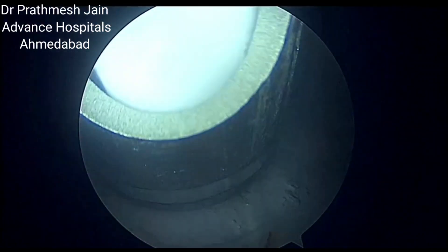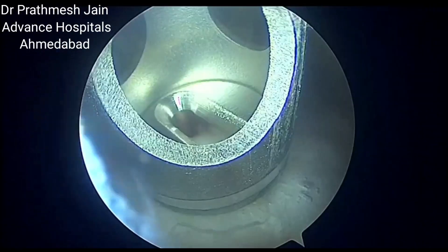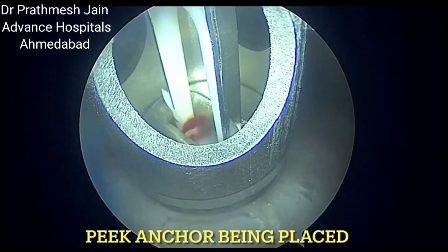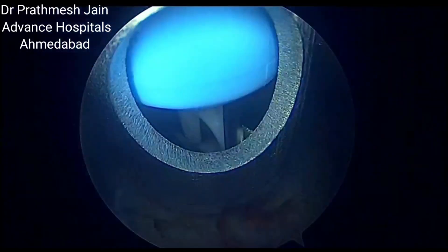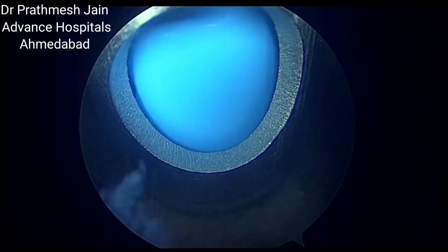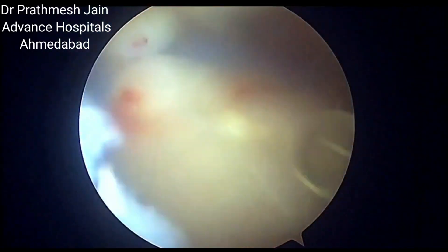Now the peak anchor comes into the picture. The peak anchor is loaded with barbs, and when we push the peak anchor, it holds the patch really nicely with the bone.